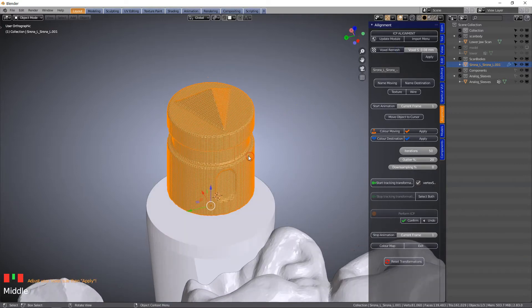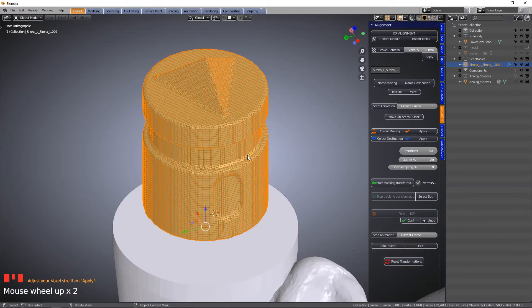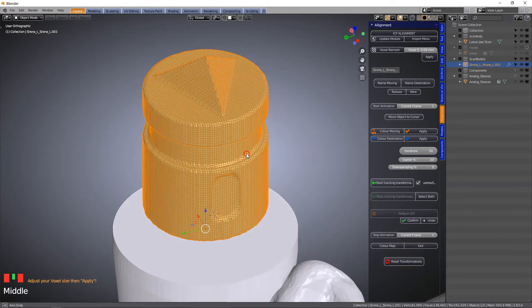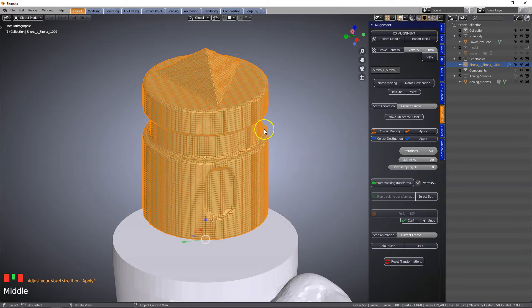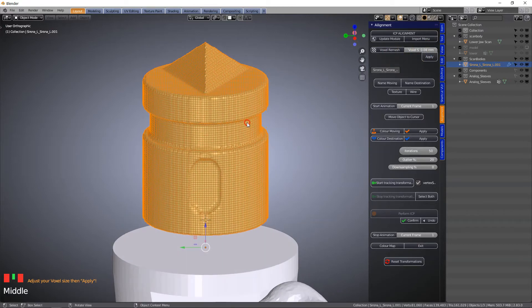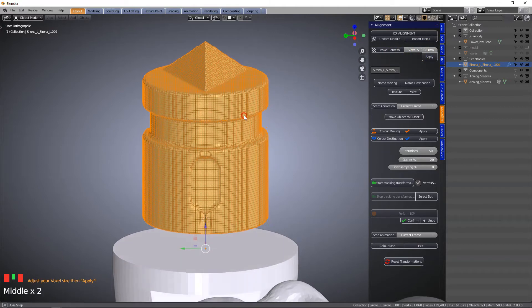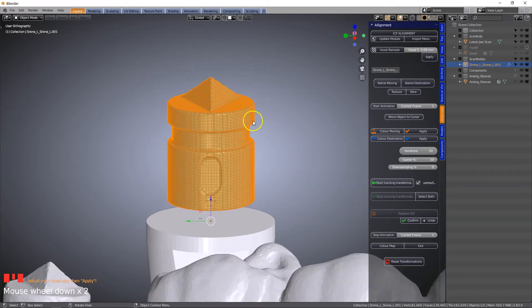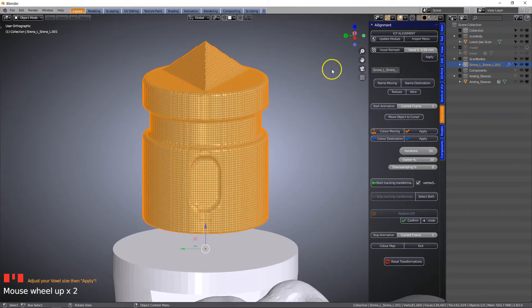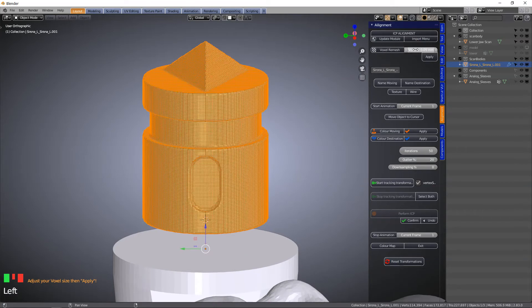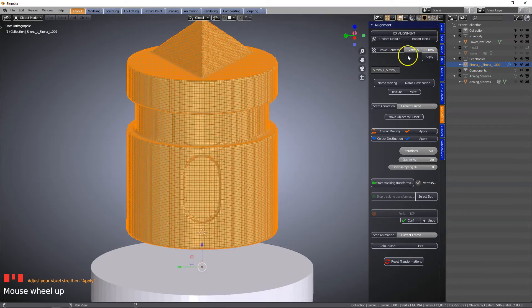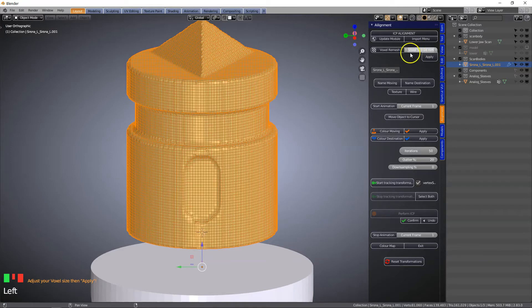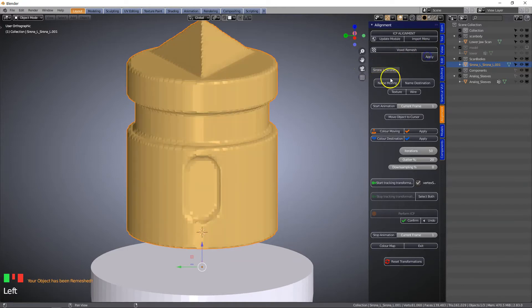It has remeshed the object. The default value 0.08 seems relatively good for using this mesh. You can change this to make it finer if you wish but it's not necessary to make it that fine. Then click on apply.